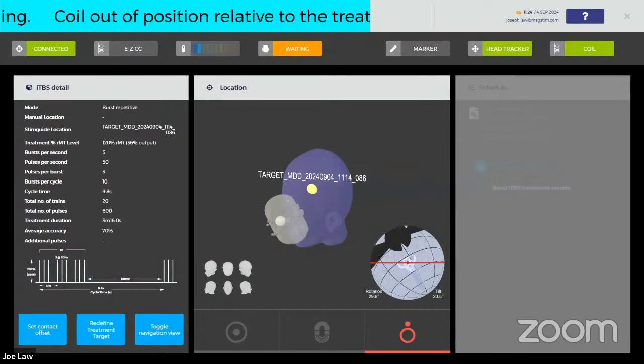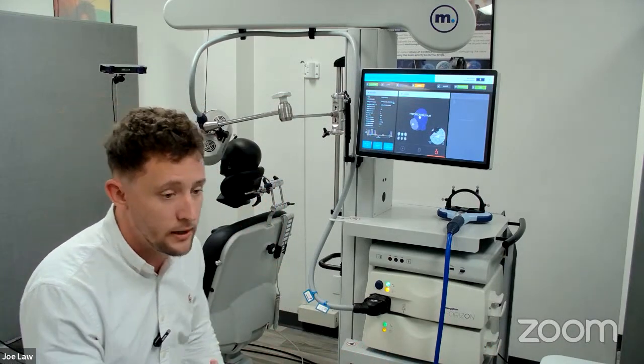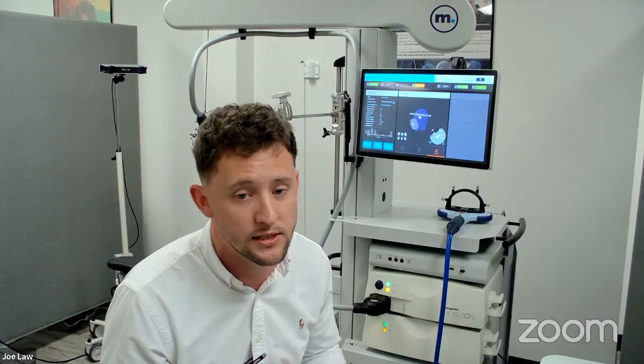Again, with the system being cloud-based, something really nice that we're able to do is, any new features or functions, we can push those updates out to you remotely. So you would just come into the office or the clinic one day, turn the system on, and it will give you an update and tell you exactly what the update was and if you want it for your system.